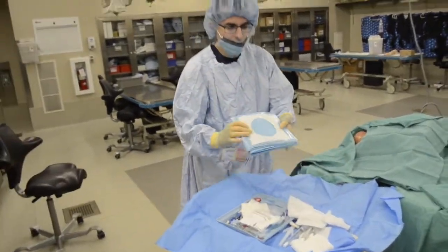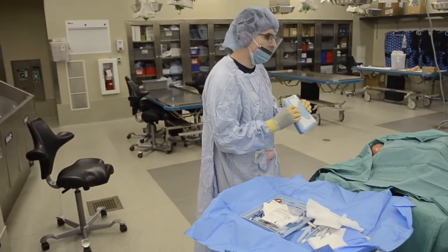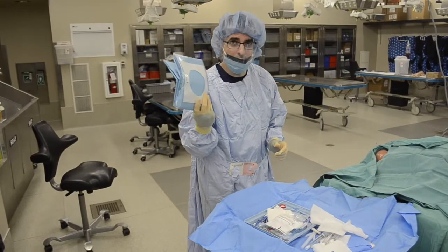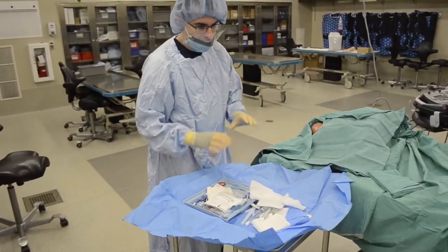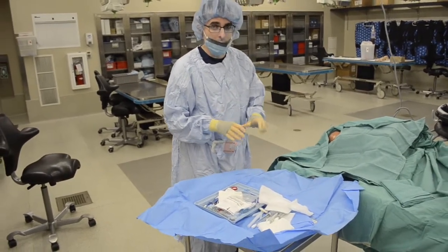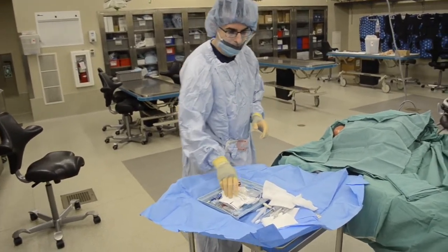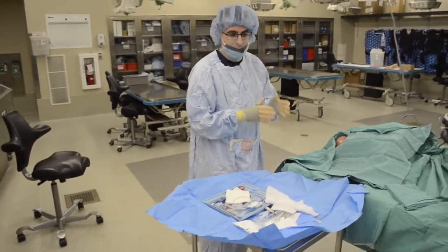And I'll just draw your attention to inside the kit is another drape. This is a plastic drape. We could have also used the plastic drape instead. We don't need this now though, so we'll just put it aside. And so I try to manipulate the kit as little as possible when I'm getting ready. Just the things that we need. And I like to set everything up stat-wise by how I'm going to use it.